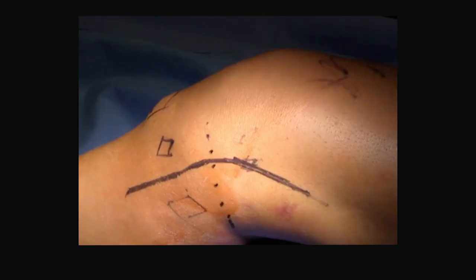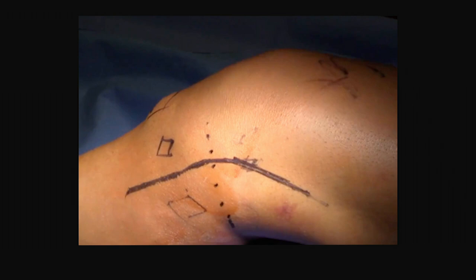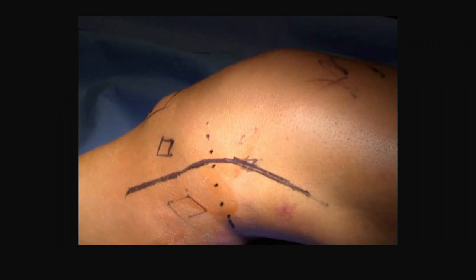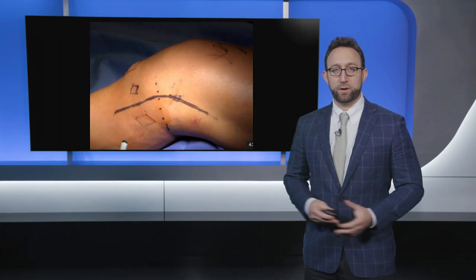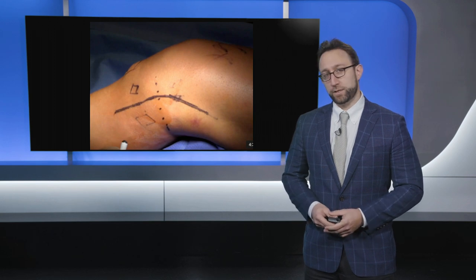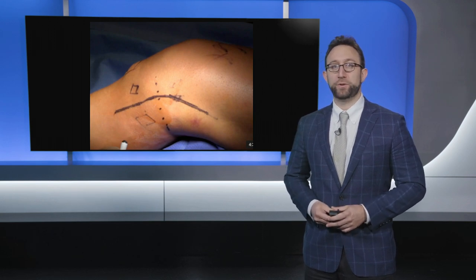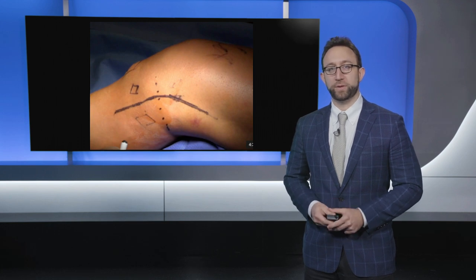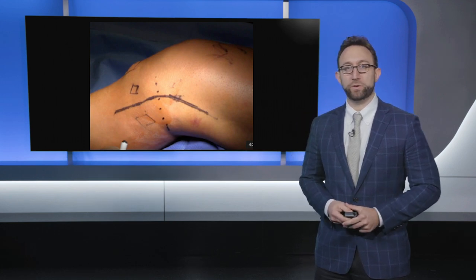Moving into the surgical procedure: this is our standard incision centered over the lateral epicondyle and between the fibular head and Gerdy's tubercle distally. The dots mark the actual lateral joint line. I tell residents and fellows to draw out the entire lateral condyle. Exposure is key — don't skimp on the incision, especially if you perform these cases infrequently. A long incision is important so you have a thorough understanding of what you find during surgery.